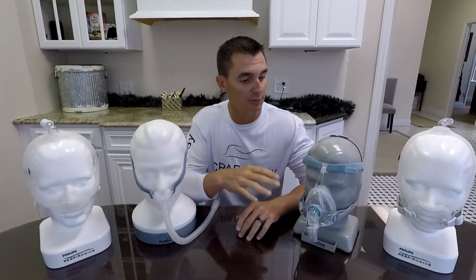Today we're going to go over a little bit of something to help people that might be making a mask change or starting CPAP for the first time. We're going to go over the different styles of masks. Technically there's three different styles: nasal, nasal pillow, and full face, but we're going to incorporate four and split the full faces from the minimal contact full faces to give you some additional options.